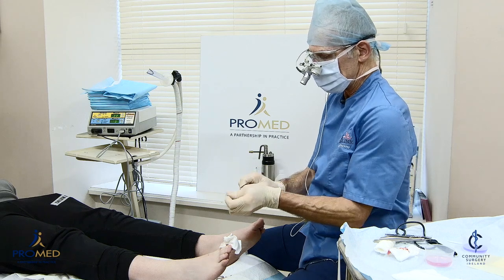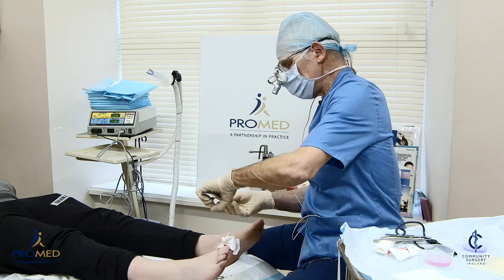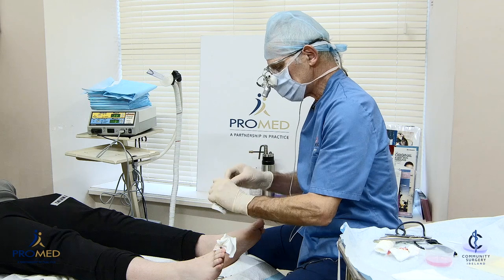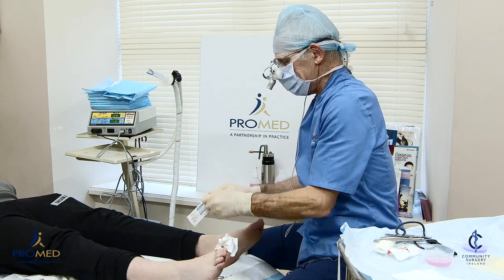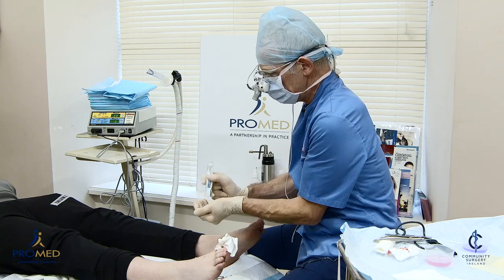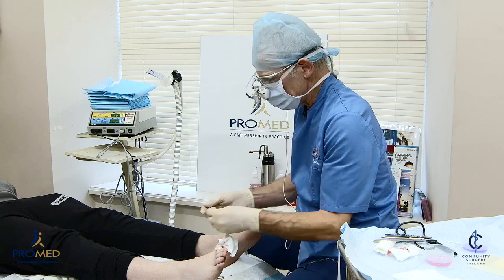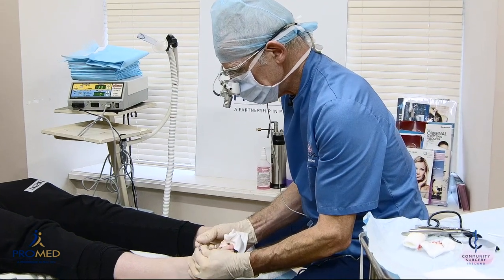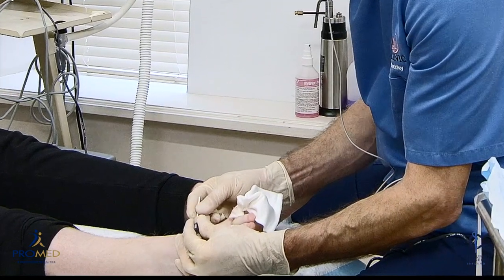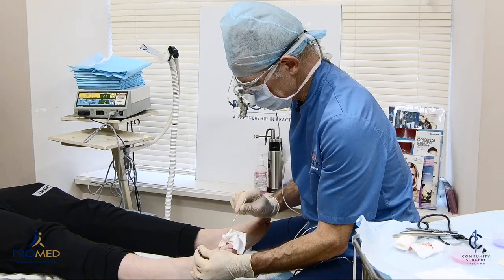It comes in a little sterile container with a little swab. You just press in like this and that soaks the swab in phenol. It's 89%, so it's very caustic and very toxic phenol. That's ready to go into the corners.